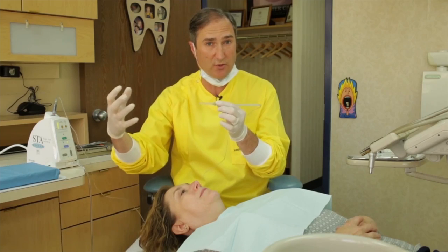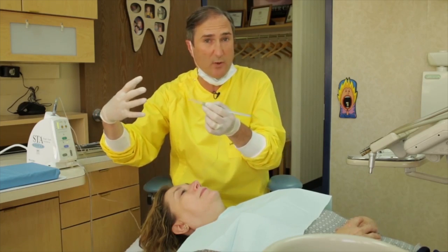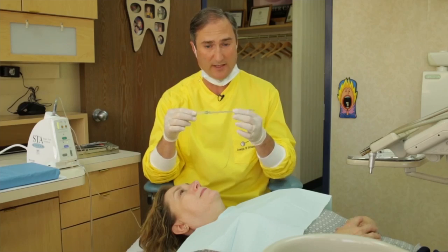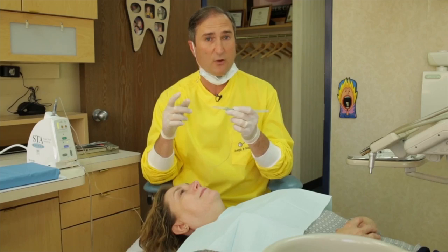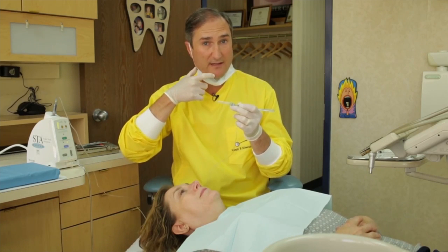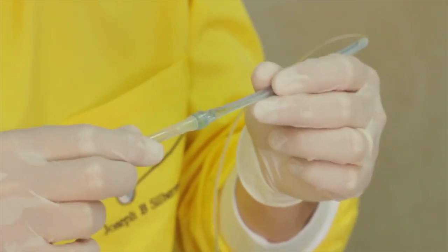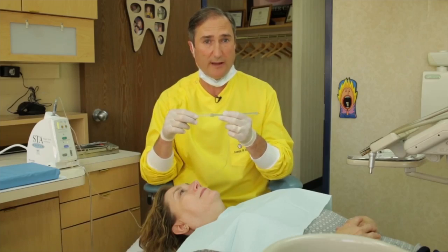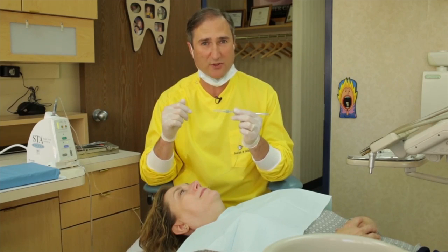And as it goes further into the tissue, it already pre-anesthetizes, so the needle keeps going in without any pain whatsoever. That's the beauty of the wand. Another great feature of the wand is that I can literally make one tooth numb at a time. Rather than making a whole lower jaw numb — I'm sure many of you have had that done — we can now do it predictably one tooth at a time and get to work right away. Let's stop talking; I want to show you how the wand actually works.